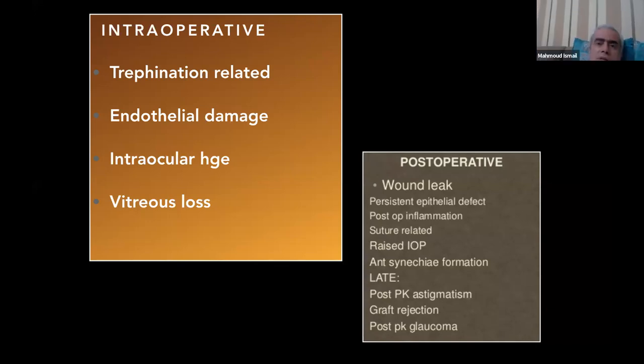If you are going to trephine a keratoconus patient, beware that you are not seeing the real center of the cornea, because the Purkinje image is altered because of the cone. So one tiny trick you have to do before applying the trephine, to find the center of the cornea with the hair cross of the trephine, is to slightly press on the cornea. Once you press on the cornea, you lower the K reading and you eliminate the keratoconus.